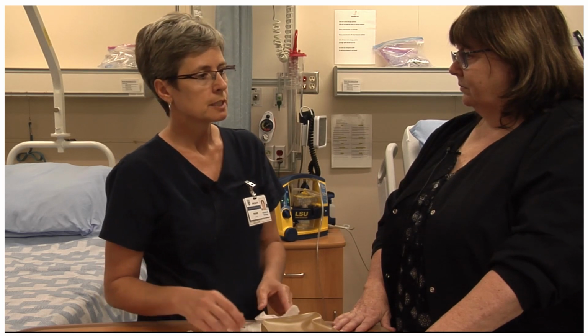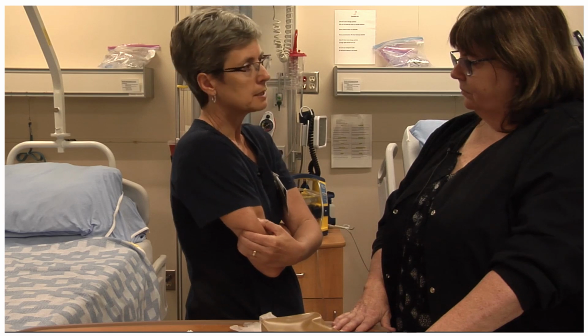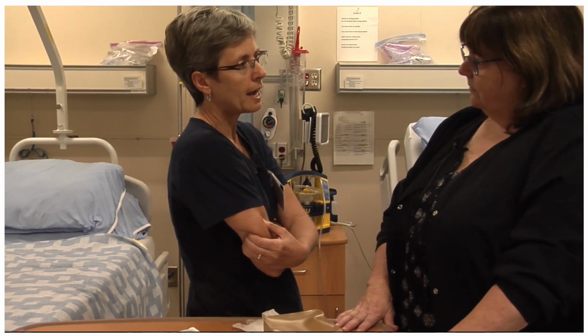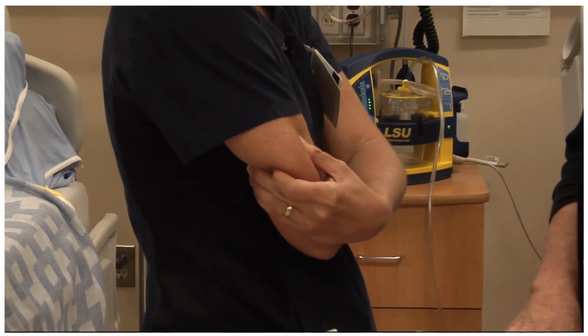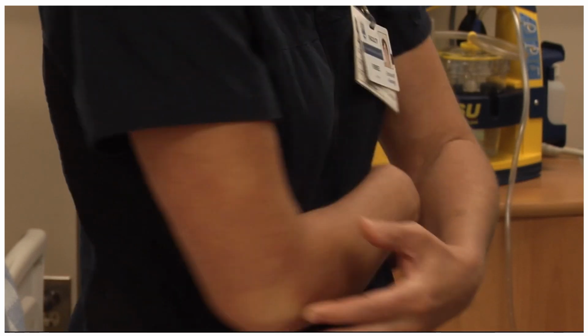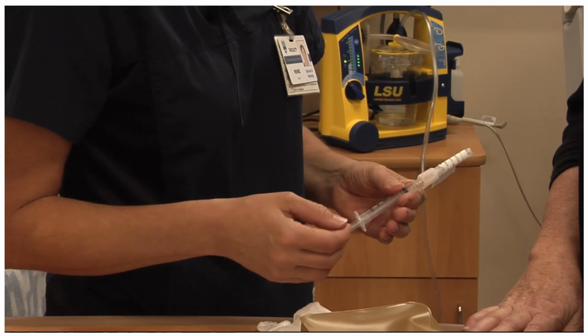Some of the literature says that when you do your pinch, you measure the base of that pinch, so between here and here? Yep, and you go for half of that distance. So in my arm, it's about 1 inch of a pinch, so I would go for a 1/2-inch needle. But I don't have a 1/2-inch needle, so I'm going to use a 1 inch and not put it in all the way. Okay.